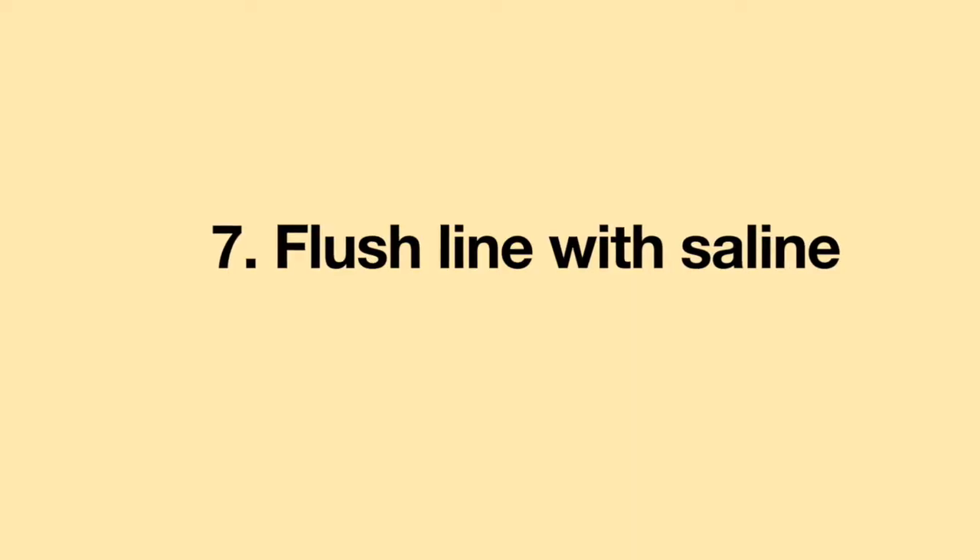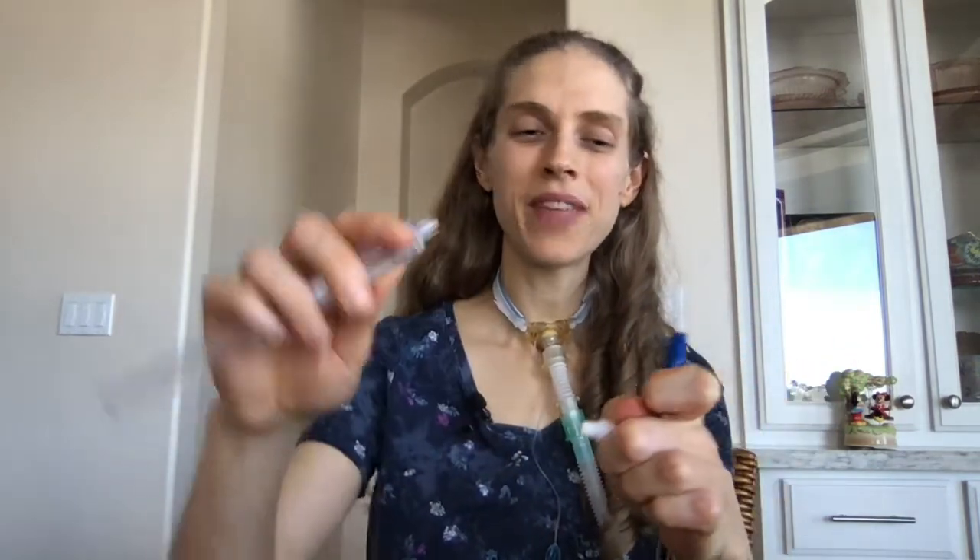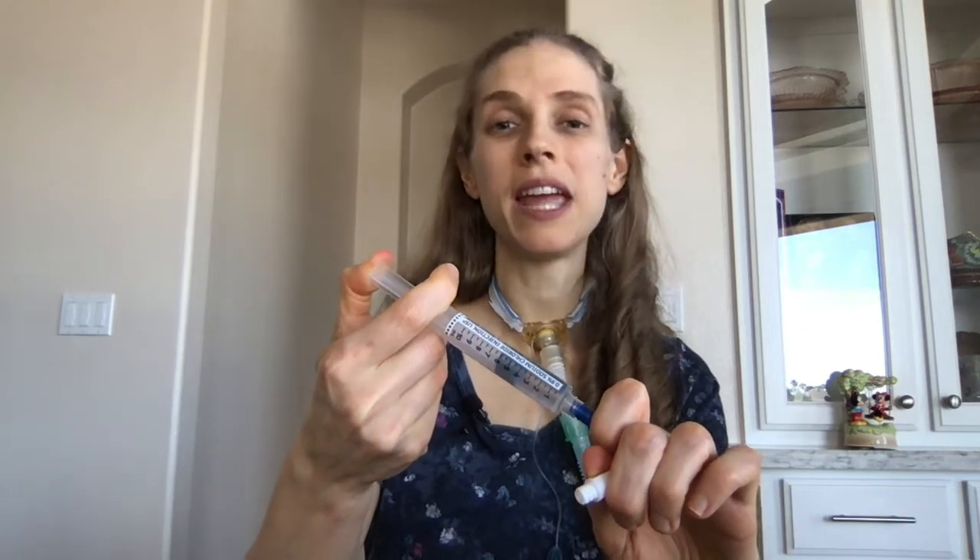The IV infusion is now complete. Disconnect by unscrewing and discard the antibiotic. Disinfect the top of the line again with an alcohol swab, scrubbing for 15 to 20 seconds, then discard the swab. Pick up another saline flush, holding it in the middle. Unscrew the top, push down, screw into place, and infuse all the saline at a nice steady rate — this flushes out any antibiotic remaining in your line.